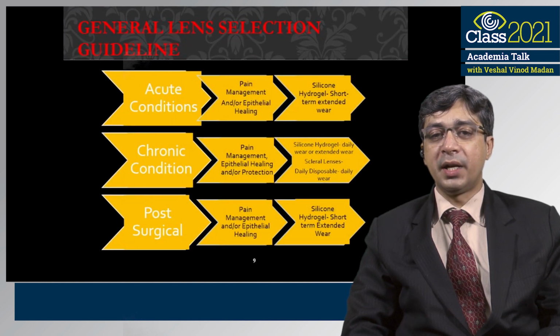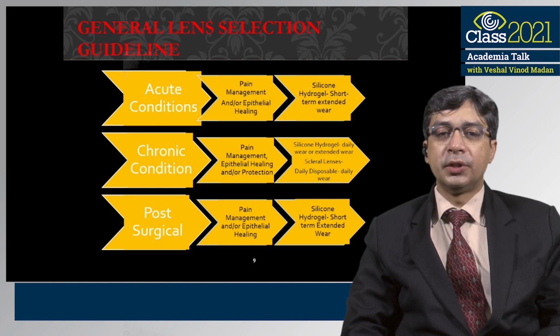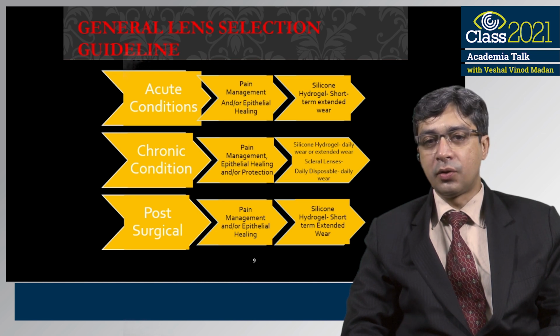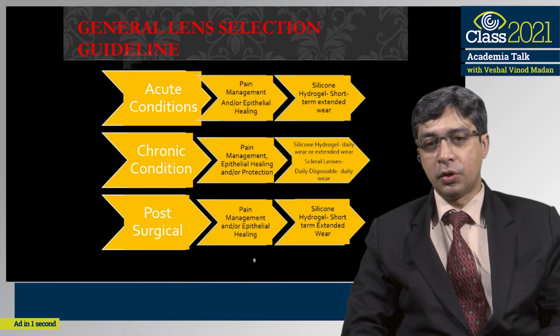Well, the journal guidelines for selection of lenses say that in case of acute conditions, there should be a management plan based on clinical signs and symptoms, and silicone hydrogel lenses should be used for a short duration of time.